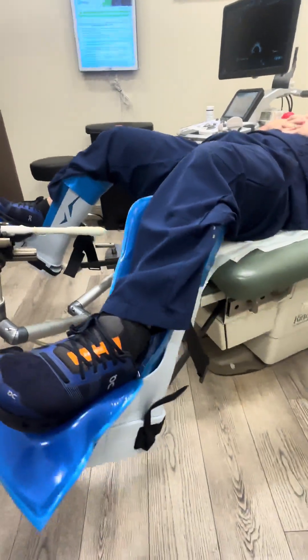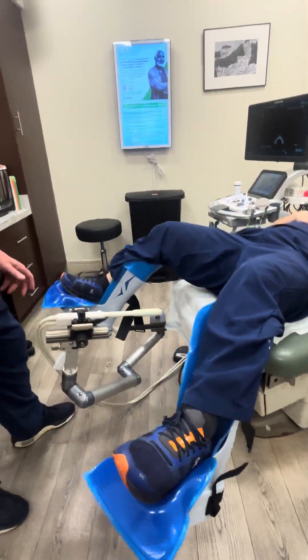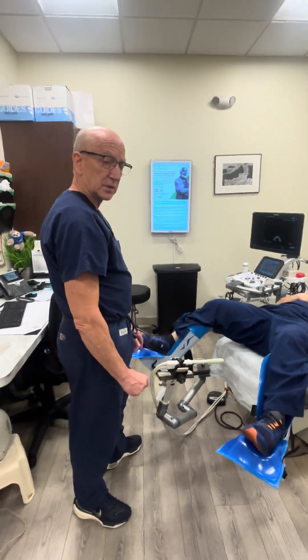Patients have had no complaints — very happy with them. They support the legs better than the regular table stirrups, and I think the patients really appreciate it.